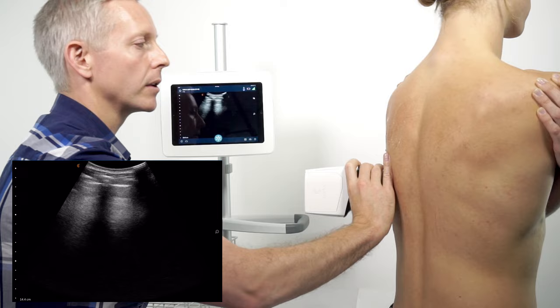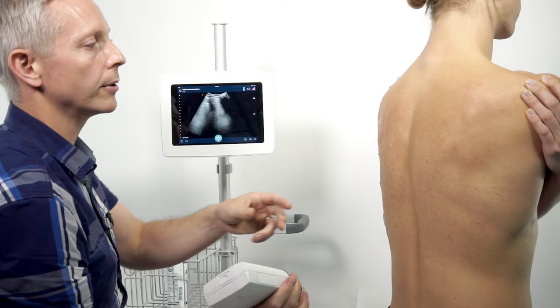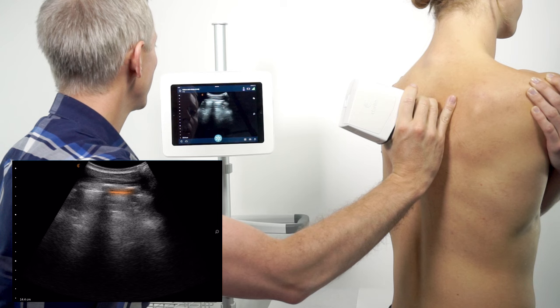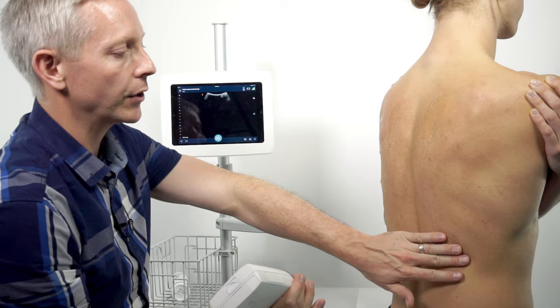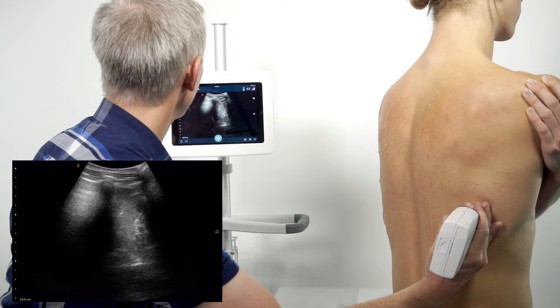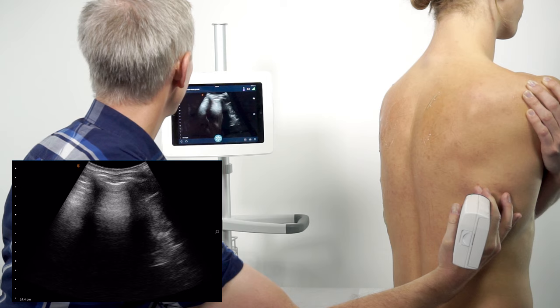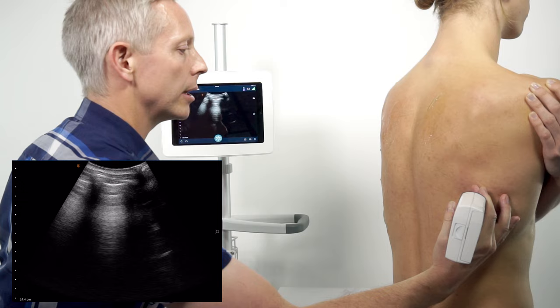Moving over to the patient's right side, I start in the superior surface of the lung. Placing my transducer and adjusting the direction of the beam to become as perpendicular to the pleural line as possible, I see that nice bright hyperechoic white surface with sliding and repeating A-lines consistent with a normal lung. Coming down to the inferior portion of the right side, I find the costal margin, place the probe just lateral on the posterior chest, and identify the liver and a little bit of kidney. Then I slide the transducer back up into the thorax, adjust the pitch to get perpendicular to the pleural line, and again note nice pleural sliding with repeating A-lines consistent with a normal lung.